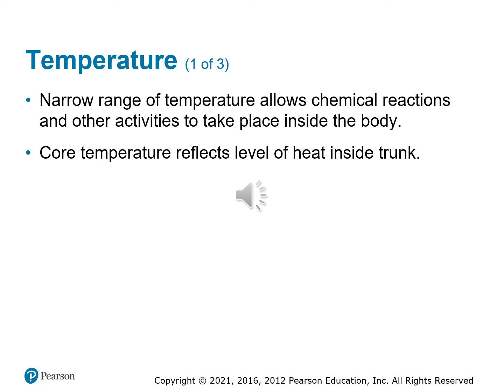But really, the temp it's a very narrow range within the body. The core temperature reflects that level of heat inside the trunk of the body. So if you want to measure a true core temp, the only way to do it is rectally. That's going to be the best temperature that you can get. If you have a hypothermic patient, you might have to do it that way. 99% of the time, you'll be able to just do an oral thermometer and get a reading that way. But we'll talk about a couple of those devices here coming up.